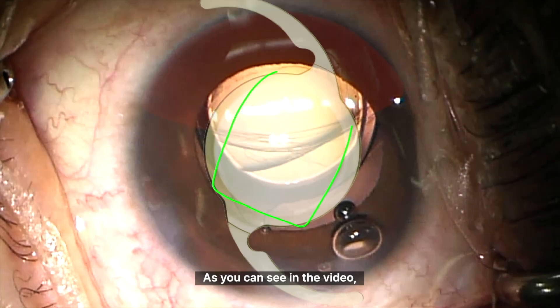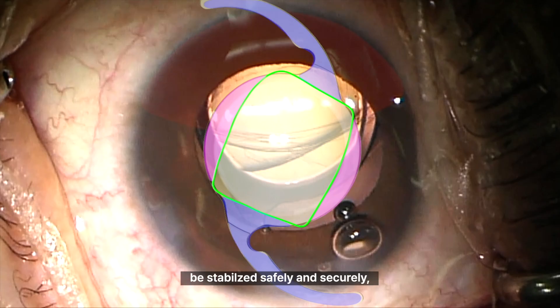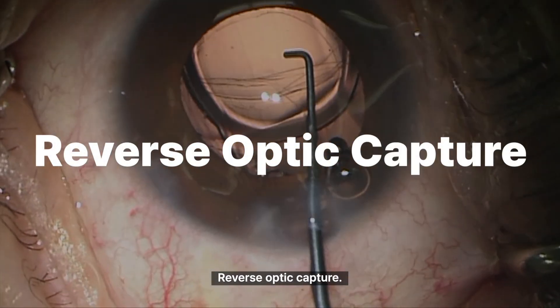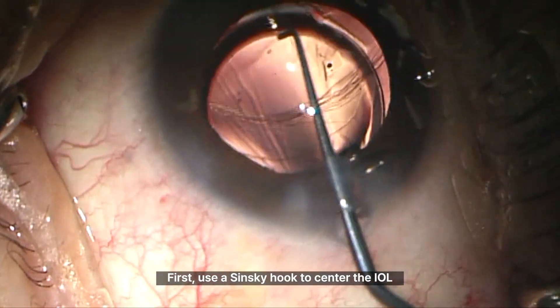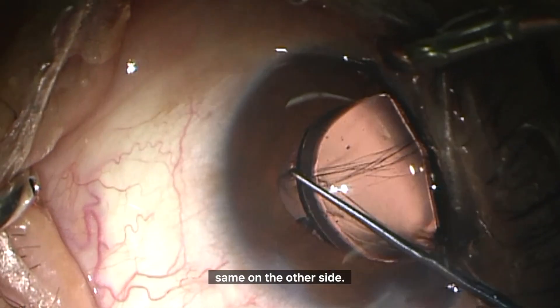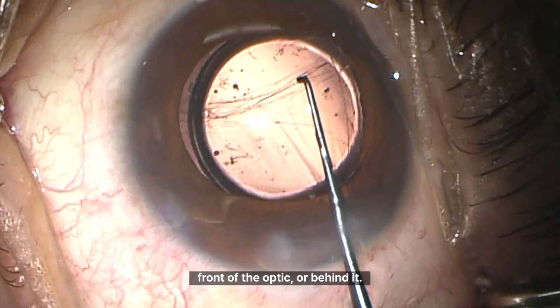This time I decided to go with Plan C: reverse optic capture. As you can see in the video, the haptics stay in the back while the optic margin is gently brought up above the anterior capsule. By doing this, even a one-piece IOL can be stabilised safely and securely, even in the setting of a posterior capsule rupture. First, use the Sinski hook to centre the IOL. Then tilt it slightly by pressing one side down and push the optic edge forward up over the capsulorhexis margin. With one side captured, do the same on the other side. Because this particular lens platform is a bit thick and rigid, it didn't feel as easy as I expected — it was tricky to tell at times whether the rhexis margin was lying in front of the optic or behind it.